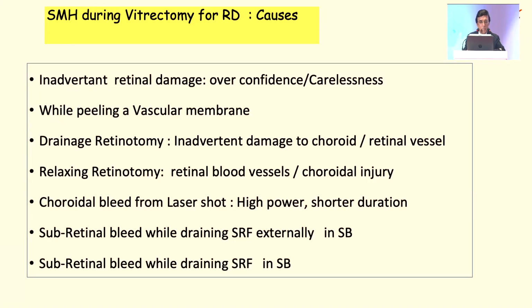It can happen while peeling a vascular membrane. It can happen during drainage retinotomy, where there can be inadvertent damage to the choroid or an adjacent retinal vessel. It can certainly happen during relaxing retinotomy if you are not very careful, or it could be a choroidal bleed from a laser shot, and I'll show you a case where we had it and how we managed it.